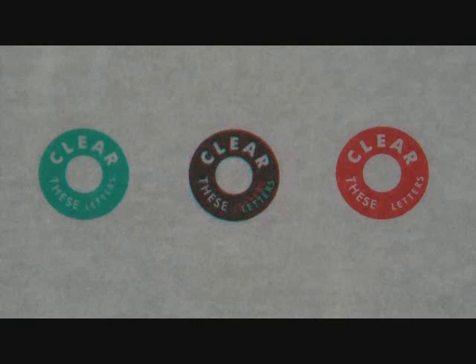The words 'clear these letters' should be clear with all letters present. You want the middle circle to float towards you with all the letters being present. It should read: 'clear these letters.'